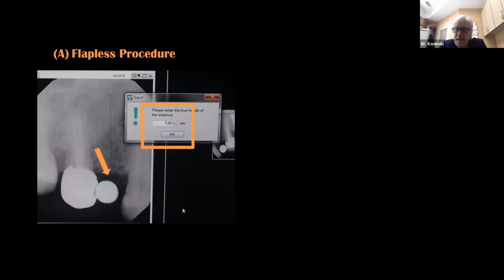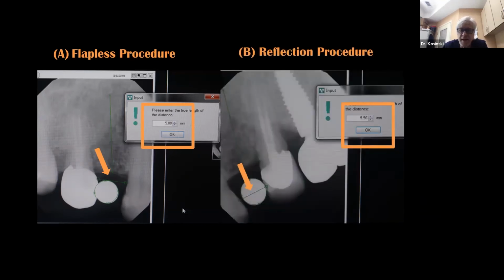The point being, and this is important, we're thinking tooth up. As general practitioners, we understand the emergence profile and aesthetics that we want to create. It's more than just placing this titanium spark plug in the jaw. We're thinking tooth up in this situation. And when you train your mind to do that, all your cases will be ideal. You won't make mistakes. You won't have the prosthetic challenges we often have with our implant dentistry today.